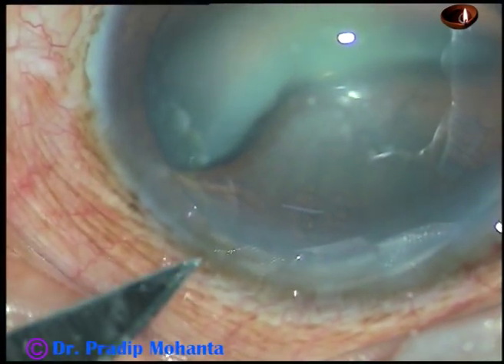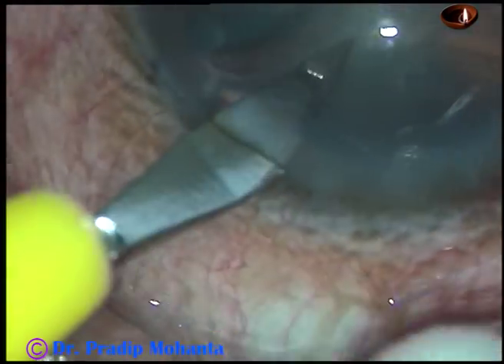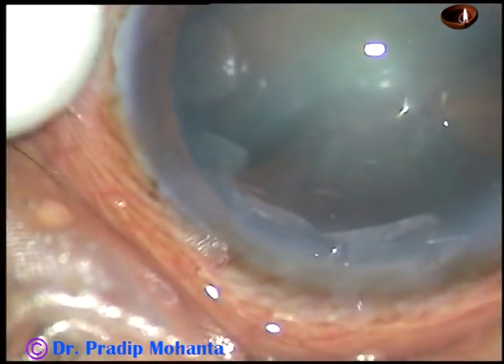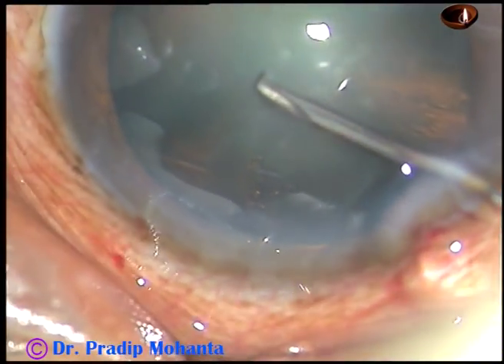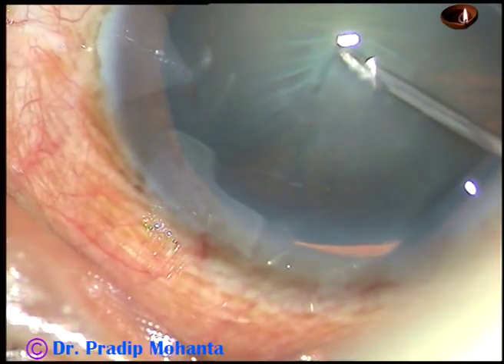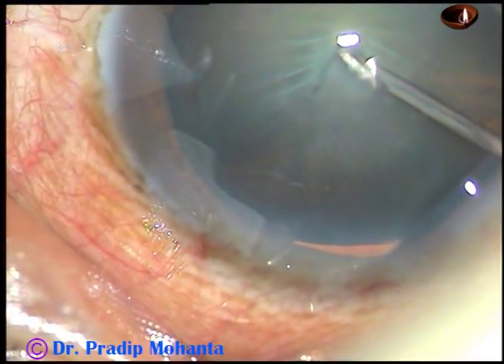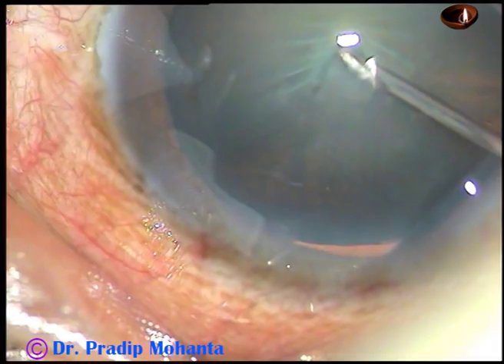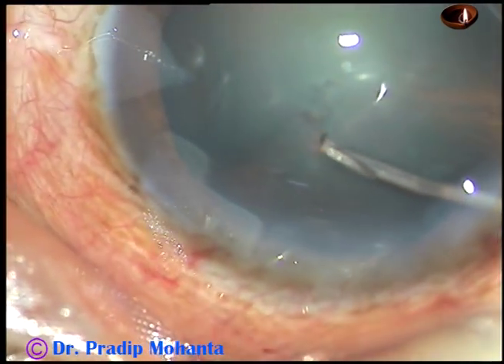I know that I am going to have a tough time in this case. The main incision and side port has been made. Now see what happens during capsular access — as I try to incise the capsule, there is wrinkling of the capsule. This indicates that there is zonular weakness or zonular dehiscence.